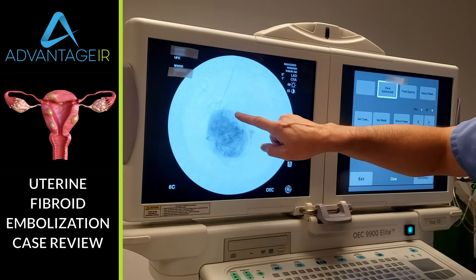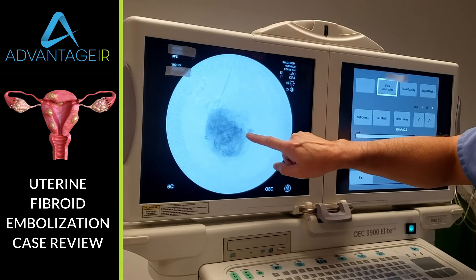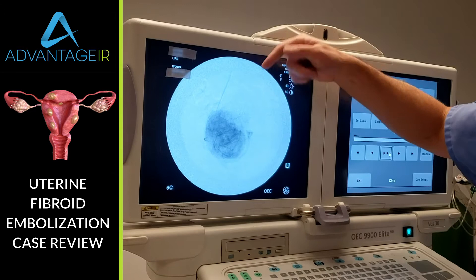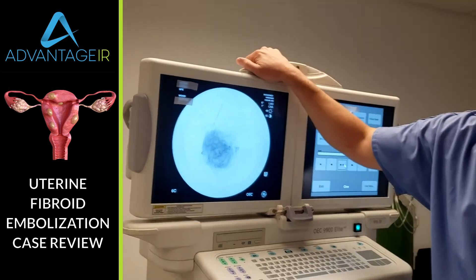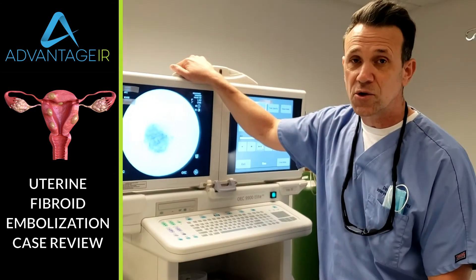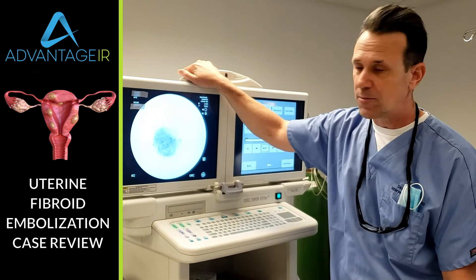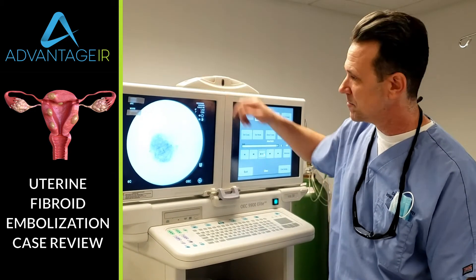This is contrast in the capillaries of the fibroid. Fibroids are very vascular — tremendously vascular. Most of the blood flow going into the uterus goes into the fibroids in this patient, and every patient with fibroids, which makes it very easy to treat with our beads.